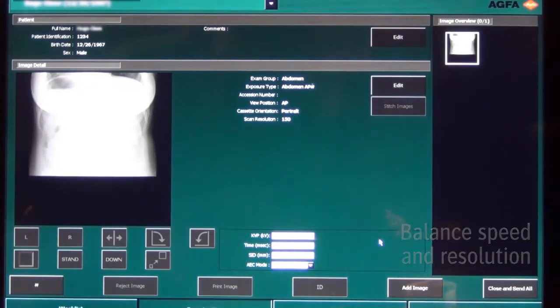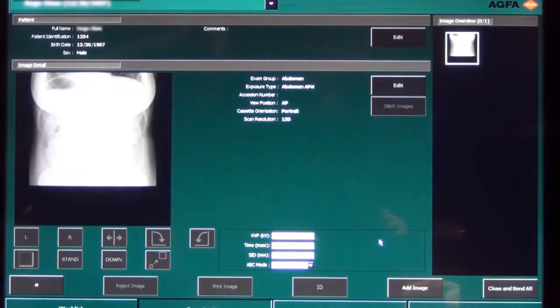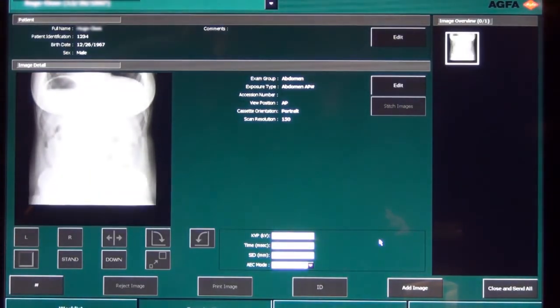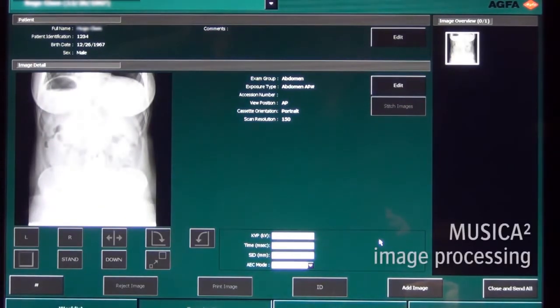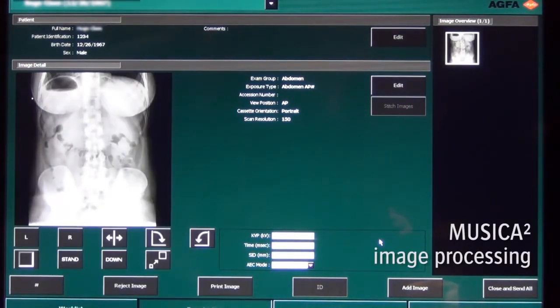While scanning the cassette, the preview image is building up. Once the image is scanned, it is processed with Musica II and ready for diagnosis.